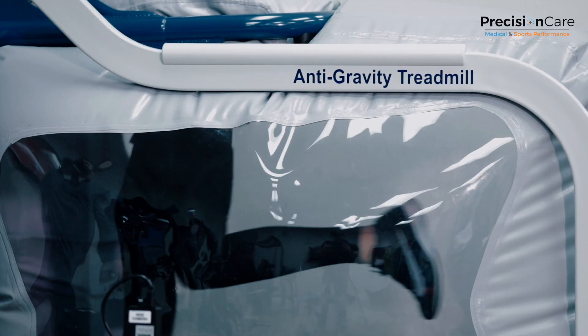Hey guys, Dr. Reina Fetter here from Precision Care Medical. Today I want to introduce you to our Ultra G Zero Gravity Treadmill.